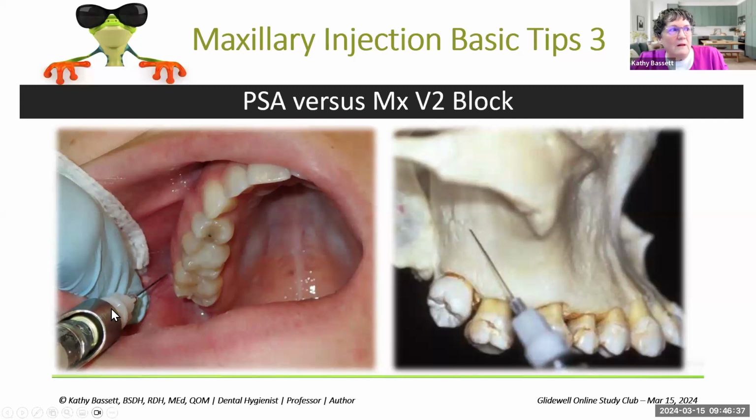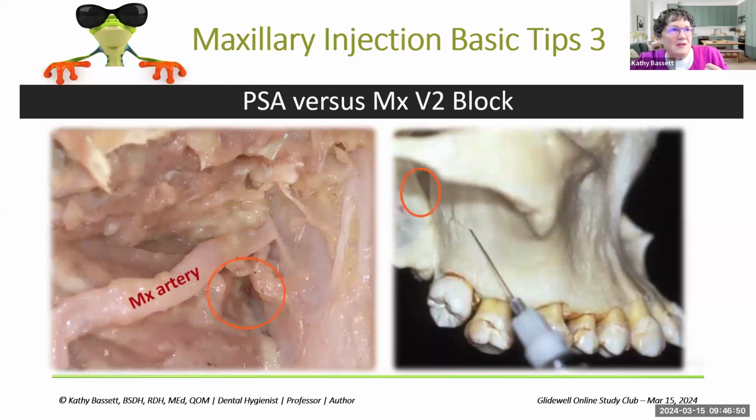With a short needle, I'm going to insert in till the front of that wide hub is just about lateral to the CEJ, and that puts my needle tip right about here. But from that earlier discussion, here's how high up that fissure is. Here's where the maxillary nerve is coming down and through. So I need to increase my depth up to here. This is about 16 millimeters of insertion.